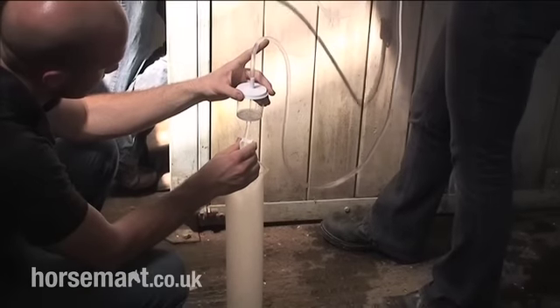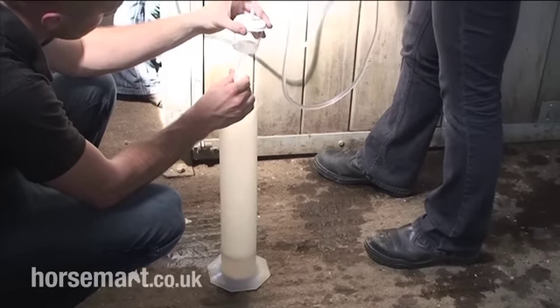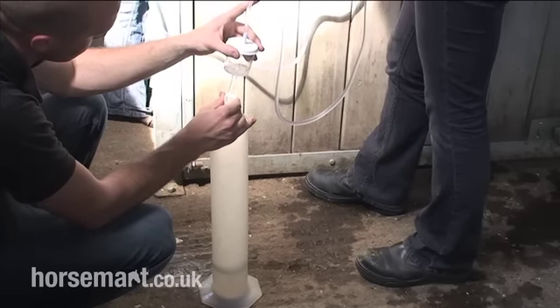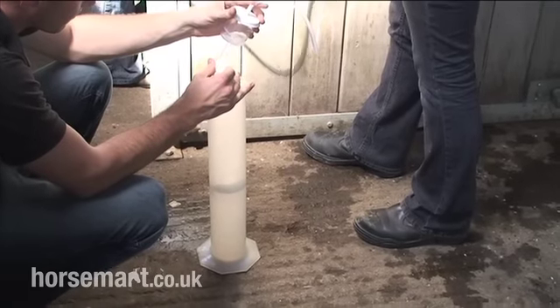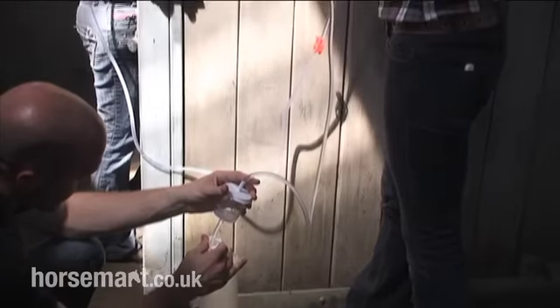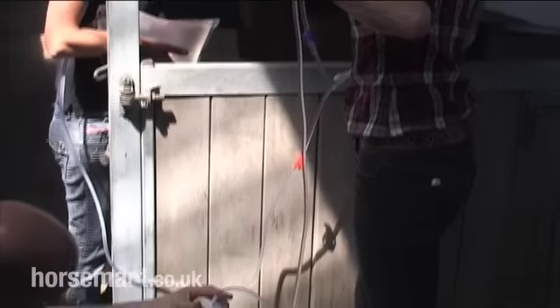The fluid is being run back out and through the filter. The trick with the filter is to make sure you have a little bit of fluid sitting in the bottom, so that if the embryo — or technically, an expanded blastocyst — comes down, it's not going to bang its head against the filter. You want it to go into the fluid portion. The art is starting and stopping the recovery: the embryo gets sucked up towards the cervix, then when you shut off the filter the drainage slows, the weight of the embryo causes it to settle back down into the uterine body. Opening the filter again creates suction, floating the embryo back up, and by repeating this you avoid not recovering the conceptus.